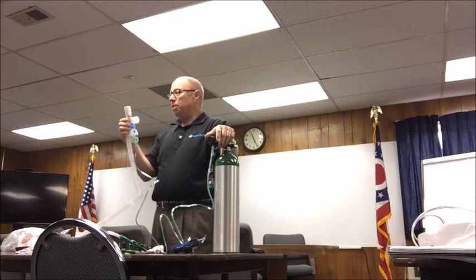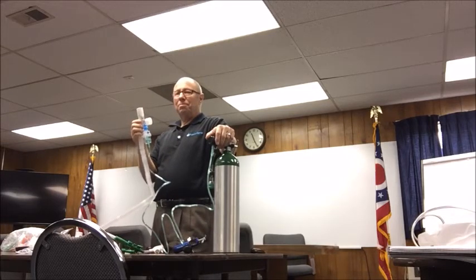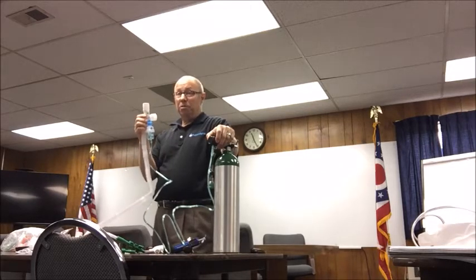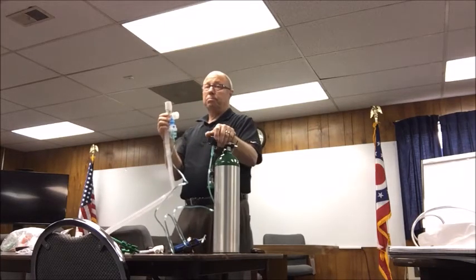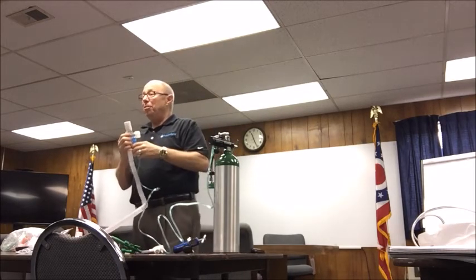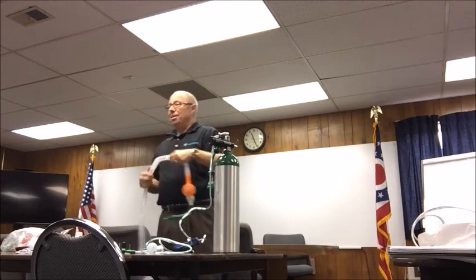Everybody comfortable with 30% FiO2? That's kind of what I was going to use. The max that system's going to deliver is just 30%. This system is, but I'm going to talk about another one that's going to help you do that. Why are you uncomfortable at 30% FiO2? I wasn't uncomfortable. I'm just asking a question because there were a couple heads shaking there. That's okay. We had one before, and then we went to one that was 95%, and it did a whole lot better.